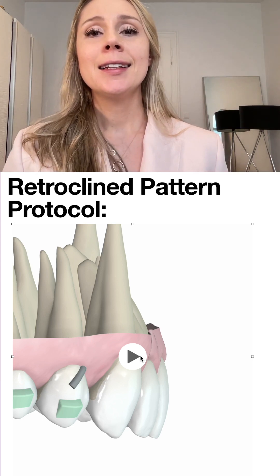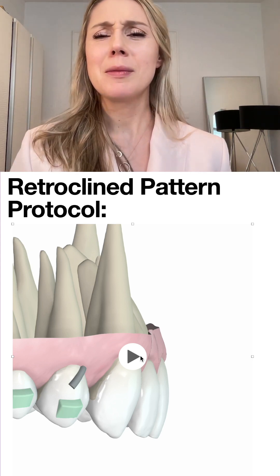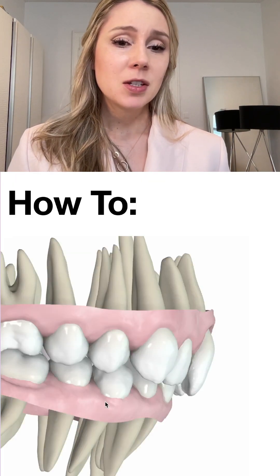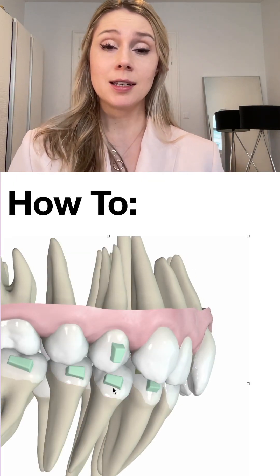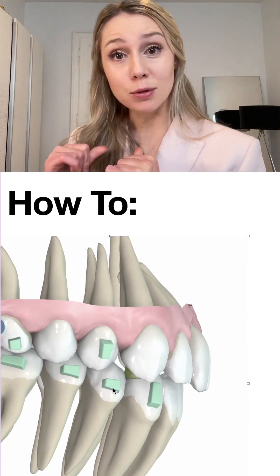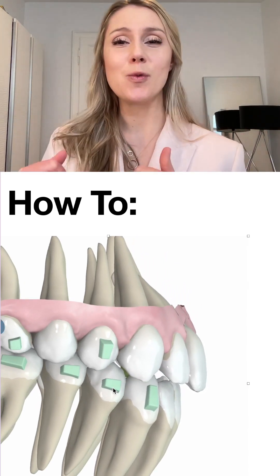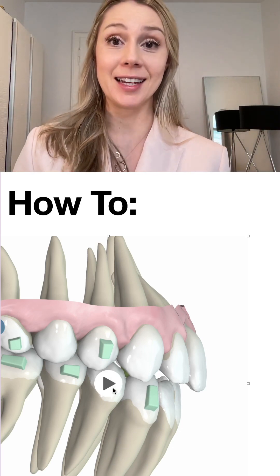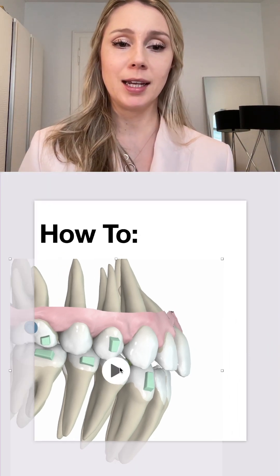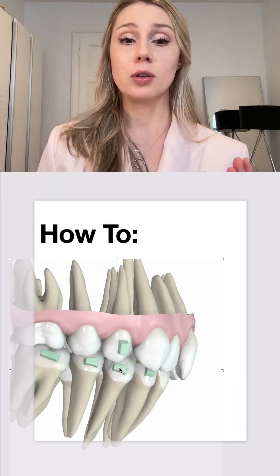The disadvantages are that it takes a lot of time, and gaps open up between incisors which is unpleasant for the patient. At some point I figured out I could plan lingual root torque from the beginning without getting aligner misfit, so now I simply do it: I plan lingual root torque from the start.